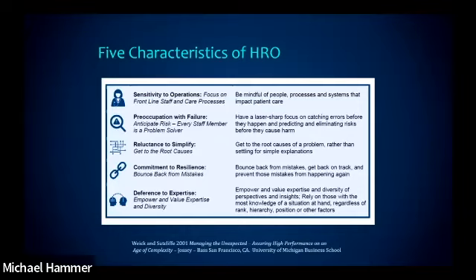You're always looking for, I'm working with this client, I'm working with this kiddo, I'm out in the yard, what could go wrong? Because adversity is right there all the time. We're preoccupied with failure so that we can anticipate what might go wrong and implement strategies before there's a problem. Reluctance to simplify is there's no simple solution to challenging healthcare issues, right?